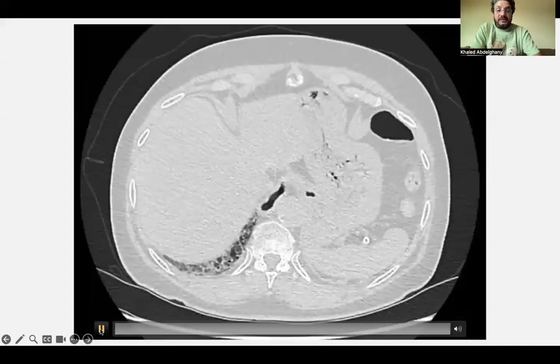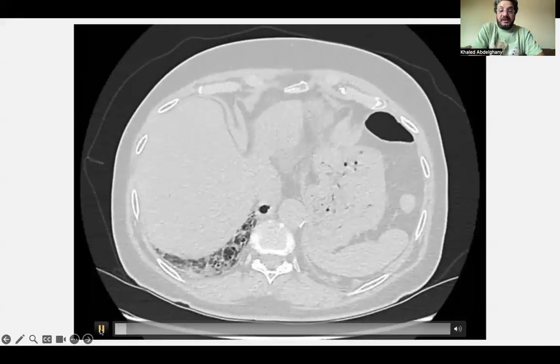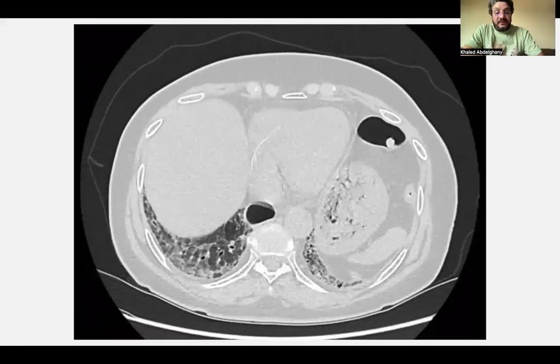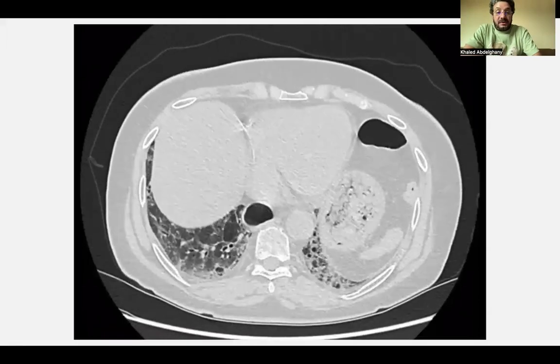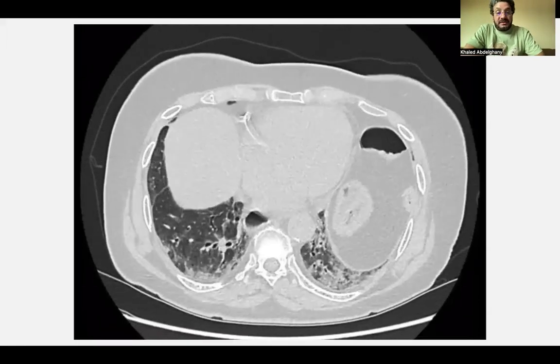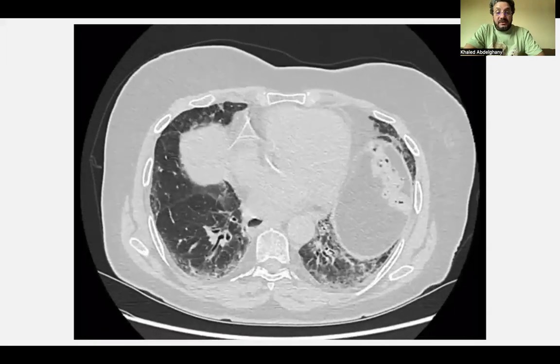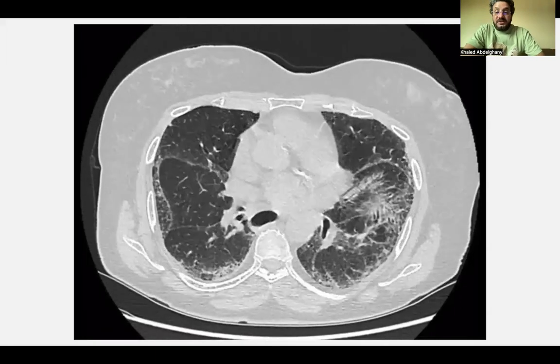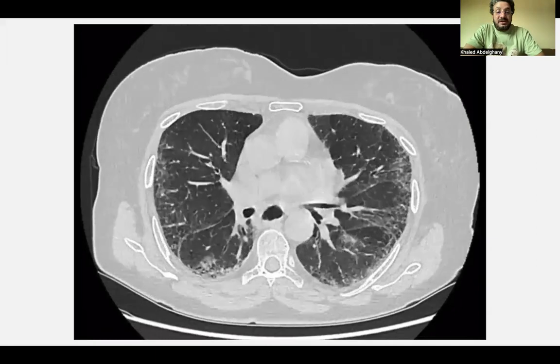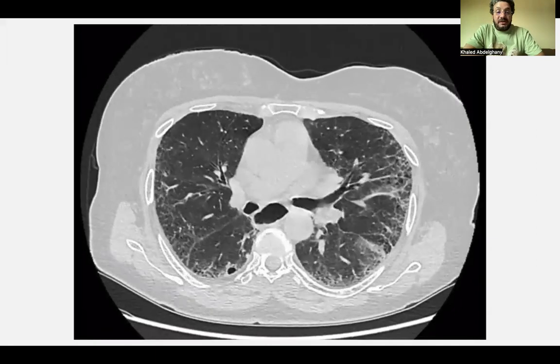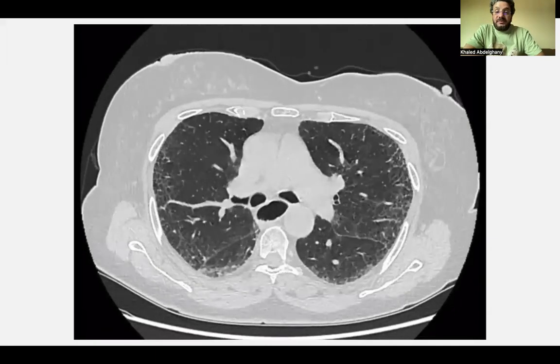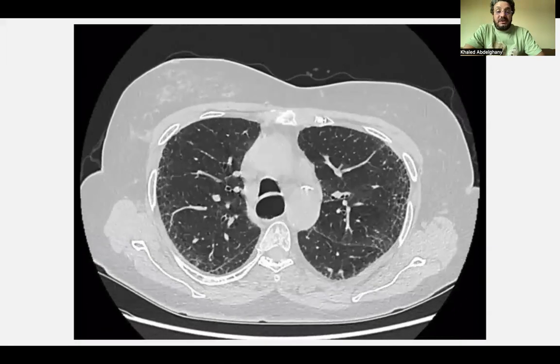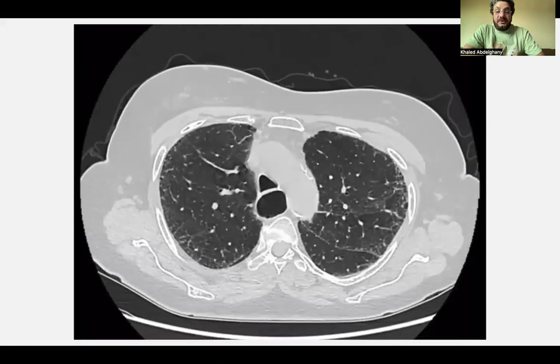We have another case of fibrosing lung disease. We have ground glass confined to the periphery with areas of fibrosis, traction bronchiectasis, and irregular reticulation and traction bronchiectasis. It appears that they are confined to the periphery.